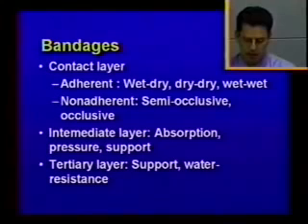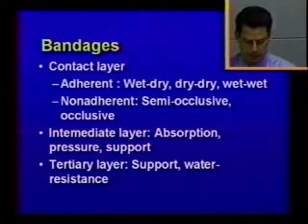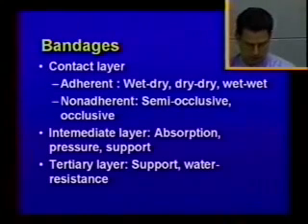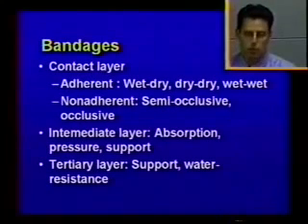Then the intermediate layer is the second layer, and this will be providing absorption and pressure relief and also support. It will also apply pressure to the wound to help with postoperative swelling in some instances. Then we have the tertiary layer, and this is also for providing support and protection and also water resistance.